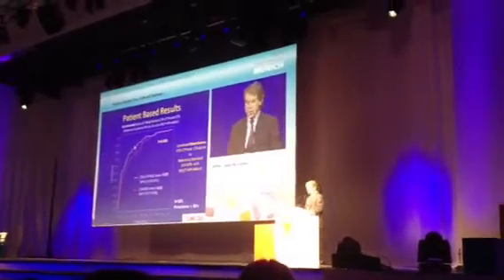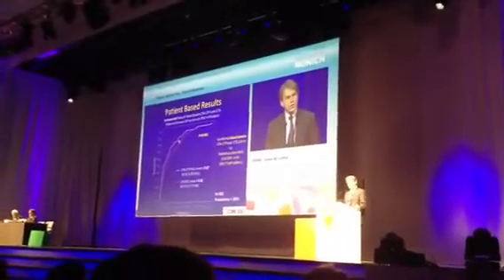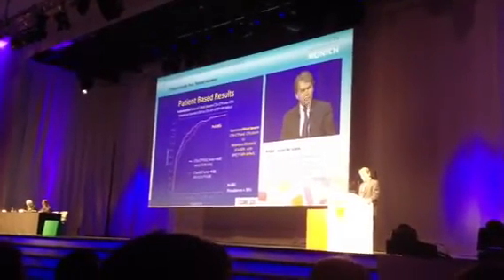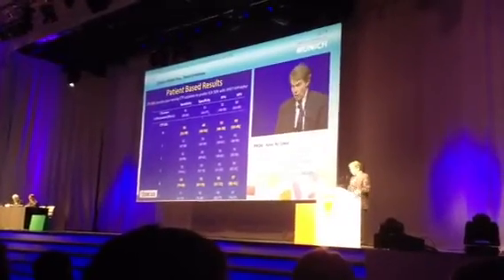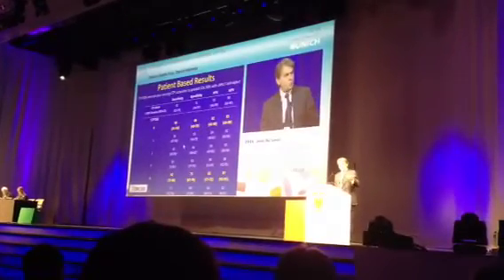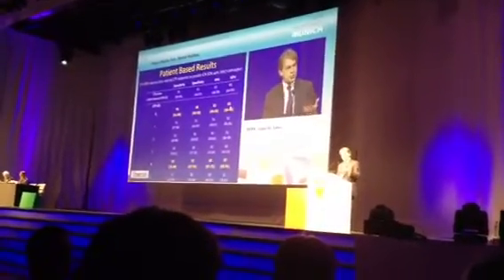Statistically significant. So in red you see the curve for CTA alone, and in white you see the curve showing the incremental value in terms of area under the curve of the CT perfusion study. How to use this? Well, if you want to use it as a screening test, then any perfusion defect being considered abnormal, then the sensitivity is extremely high, the negative predicted value is extremely high.